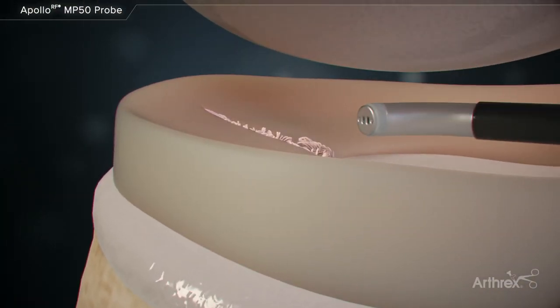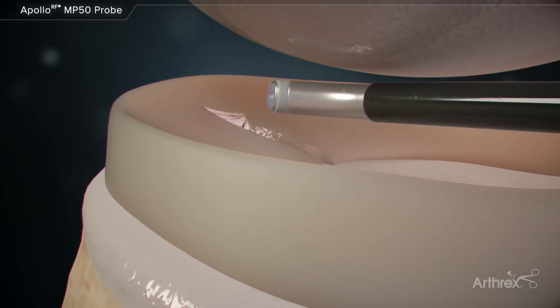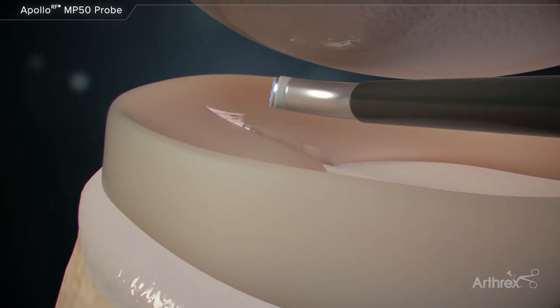The anatomical curve of the MP50 is ideal for meniscal debridement. A torn meniscus can be quickly debrided to smooth out fibrillated tissues.